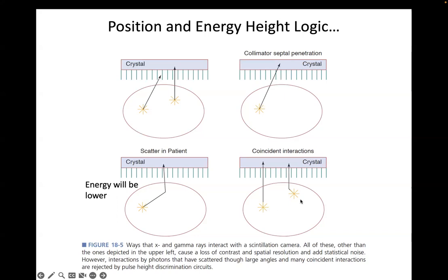The other thing that can happen is you can get a good signal here. Everything just went right. Here we had a change in energy because we get a scatter of this photon and it comes up here. Now we have flashes that are coincident, and the system tries to compute where that flash came from using the weighted sum of those signals. It might pass the energy threshold, because it certainly has high enough energy.